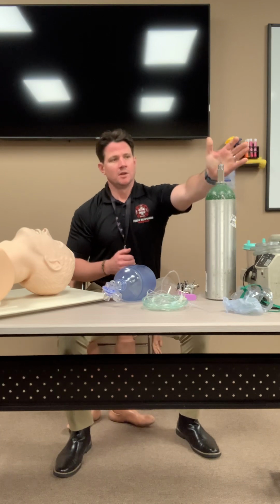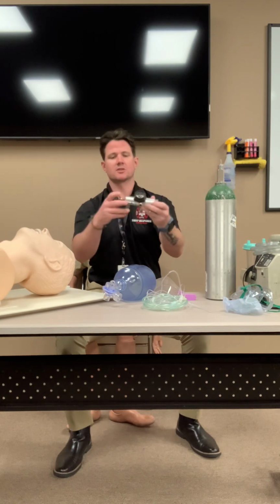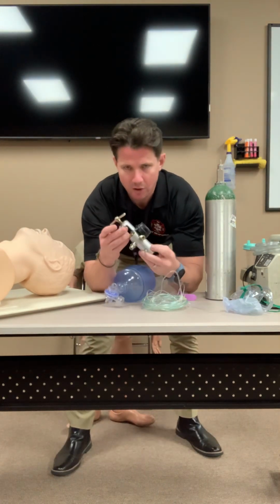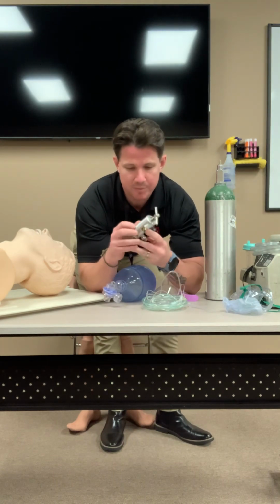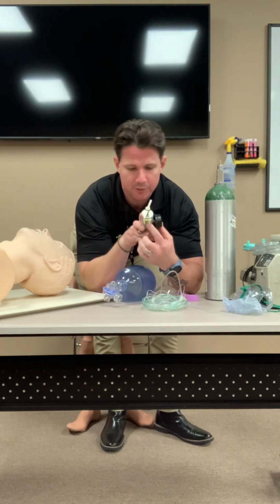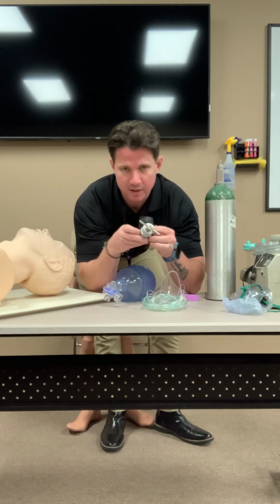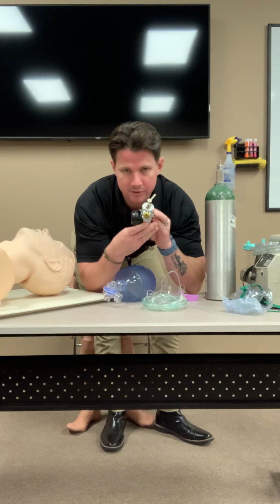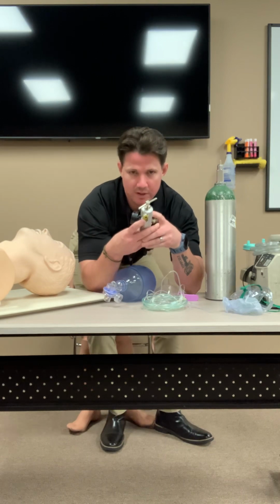Once you've cleared any debris, you're going to grab your regulator. This is an oxygen regulator. I know this is a medical grade oxygen tank regulator because it has the pin index safety system, the 3-prong system. There are 3 prongs in here, and also, it's kind of hard to see on the video, but there's a yellow piece inside. That's called a gasket. That is also something that you need to look for.